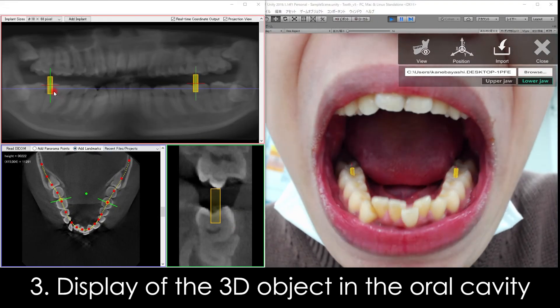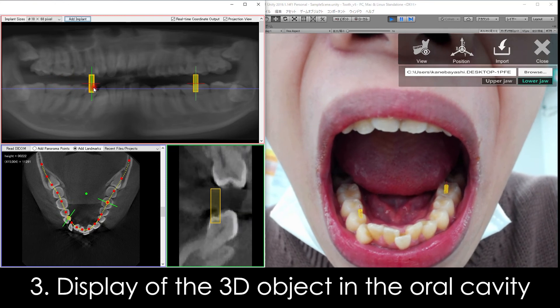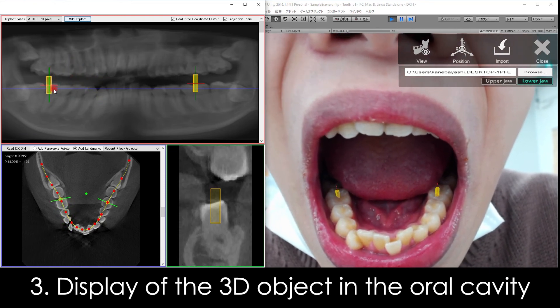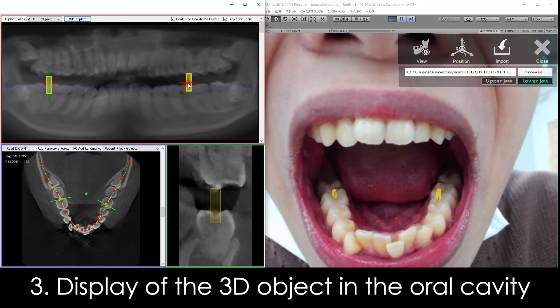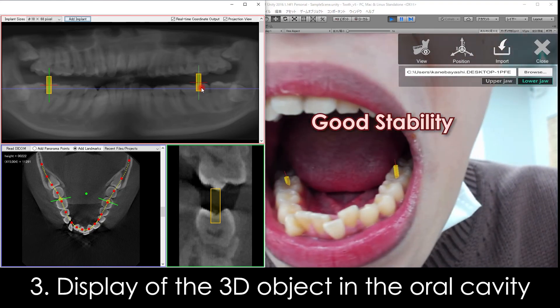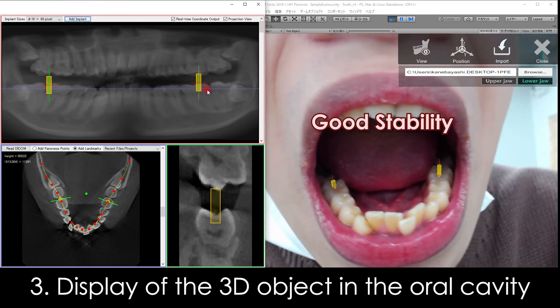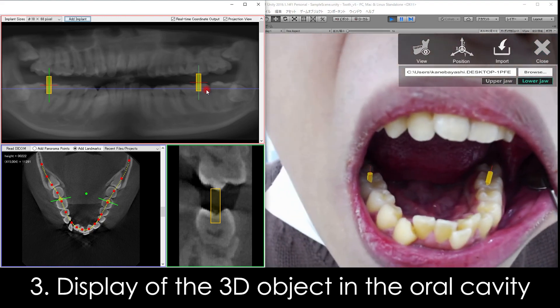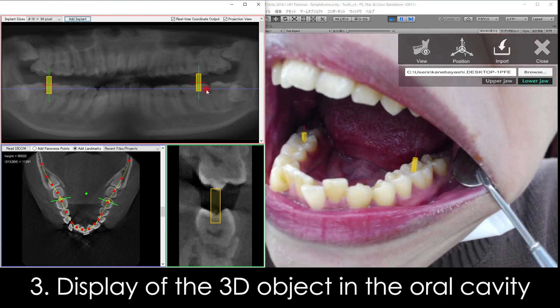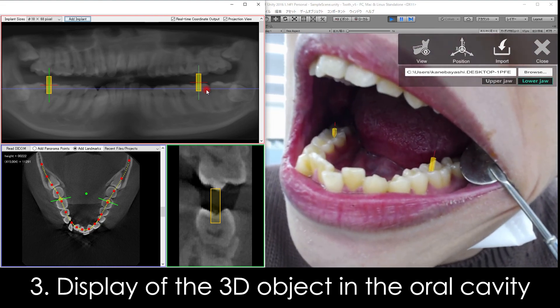We examined our system in the staff's oral cavity. The 3D objects move in conjunction with the implants on the simulation software screen, and these 3D objects are also very stable. Unlike the plate-type surgical navigation systems, our system has nothing to interfere with the operation in the oral cavity.